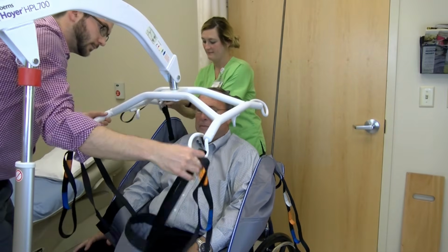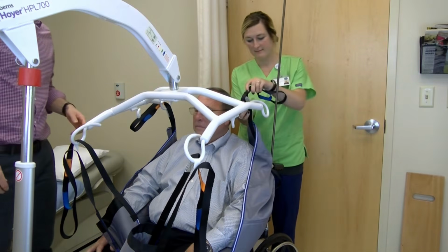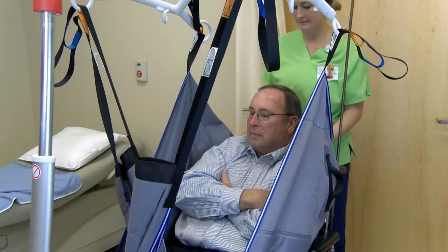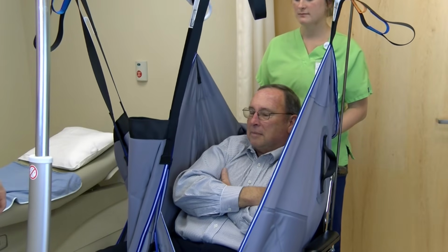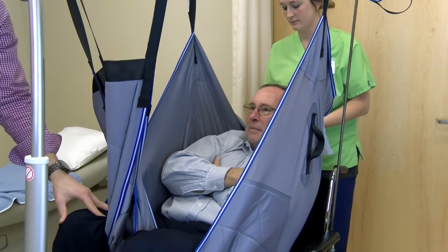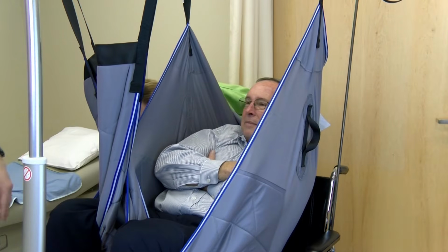Attach the top straps, the ones by the patient's shoulders, to the sling bar, making sure again to use the same color on both sides. When attaching the straps, make sure that the front straps under the legs are one notch lower than the shoulder straps. Make sure that the patient's arms are crossed and inside the sling. Unlock the rear casters of the Hoyer. Slightly raise the patient with the lift, just enough so that the patient's bottom is almost off of the chair. Double check that all of the straps are secure.